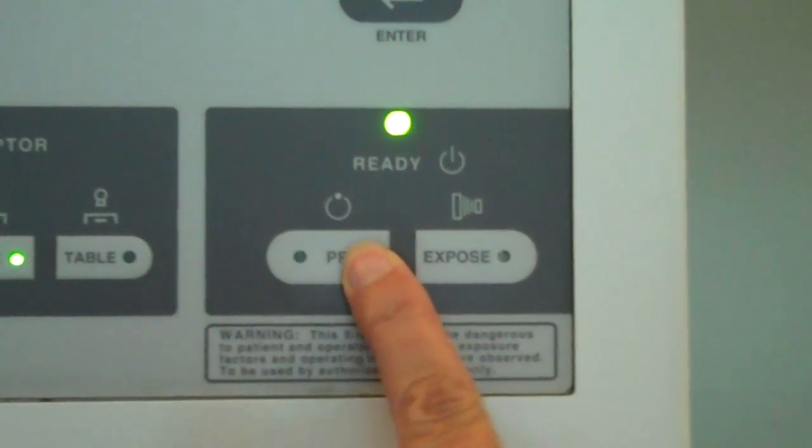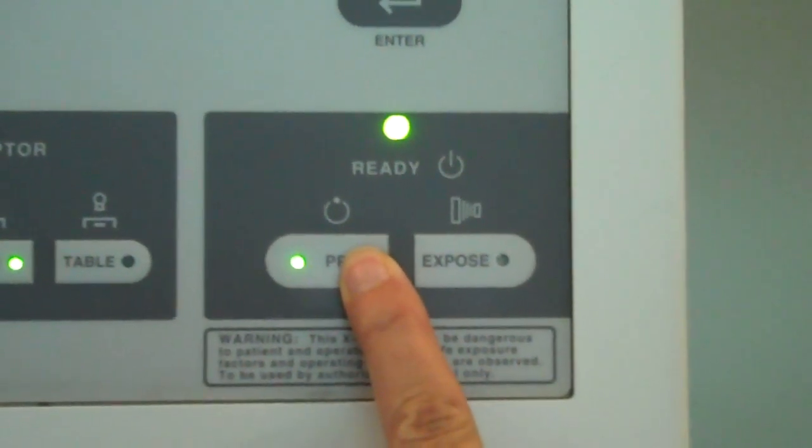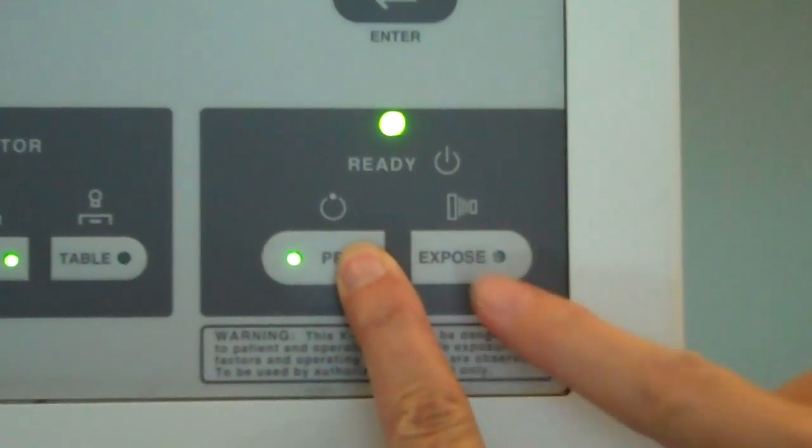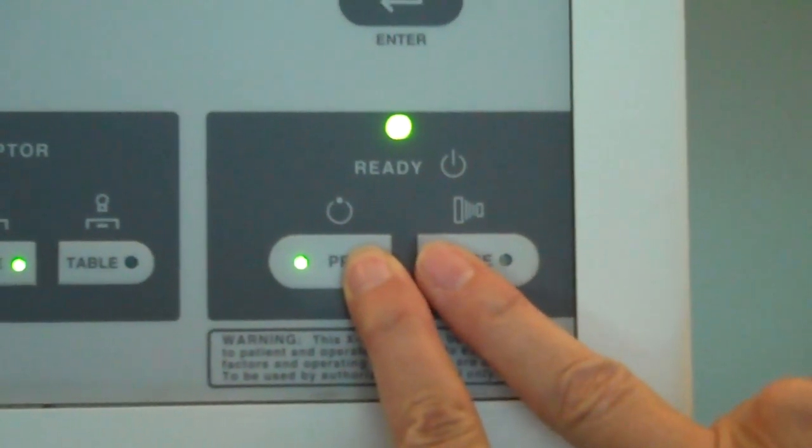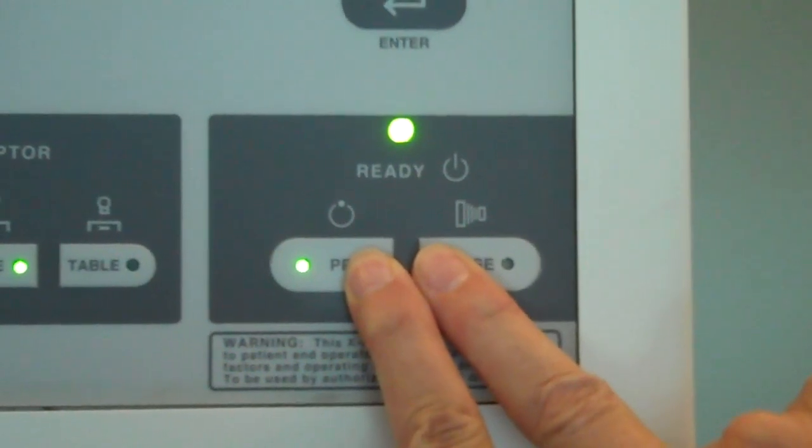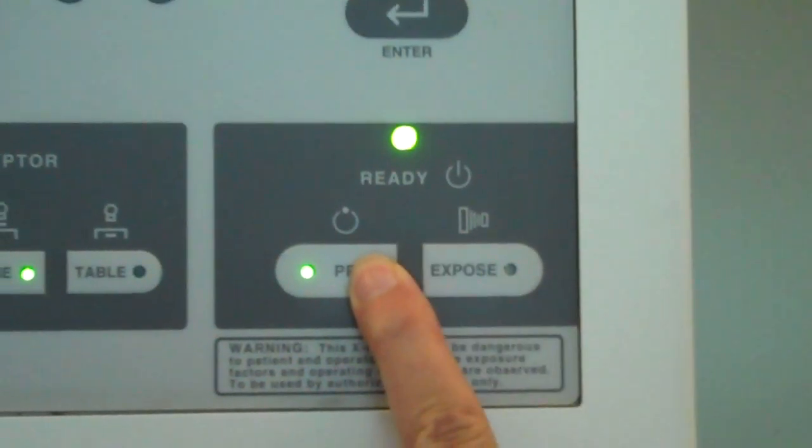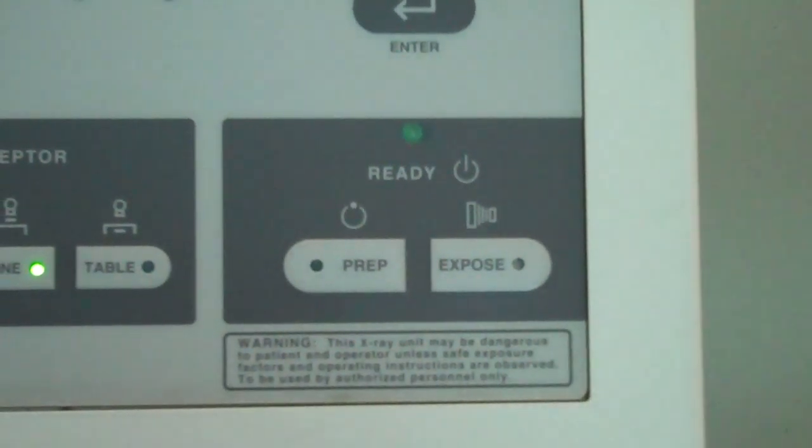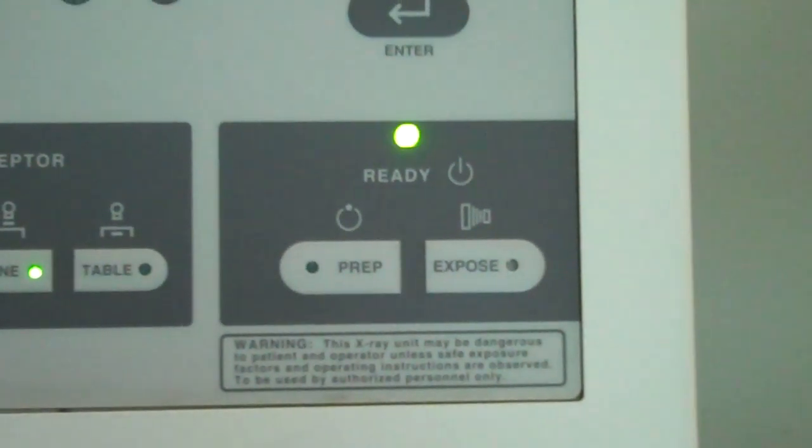Select the prep button. When the green light comes on, you are ready for exposure. We are ready for exposure and we have taken an exposure in Lab A.